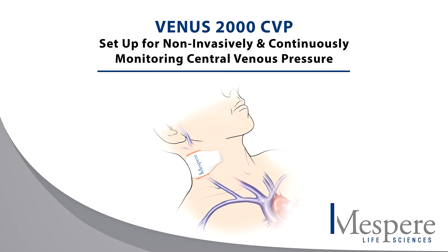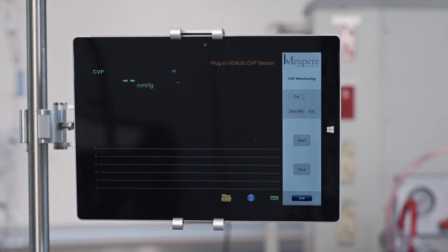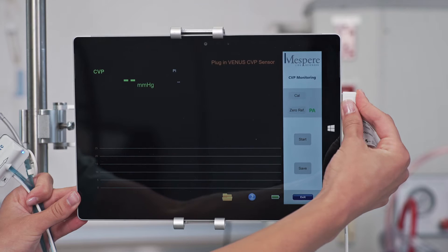The following demonstrates the Venus 2000 CVP setup for non-invasively and continuously monitoring central venous pressure. Choose the CVP application. As instructed, plug the Venus 2000 sensor into the monitor.